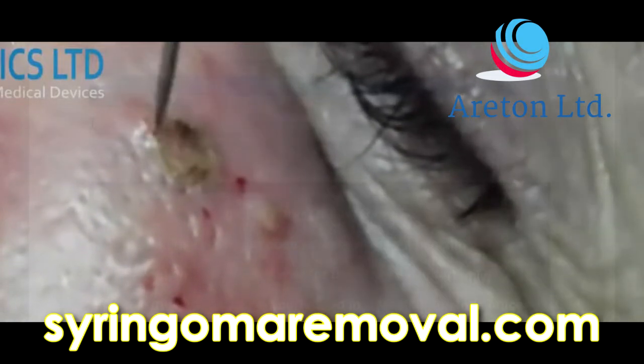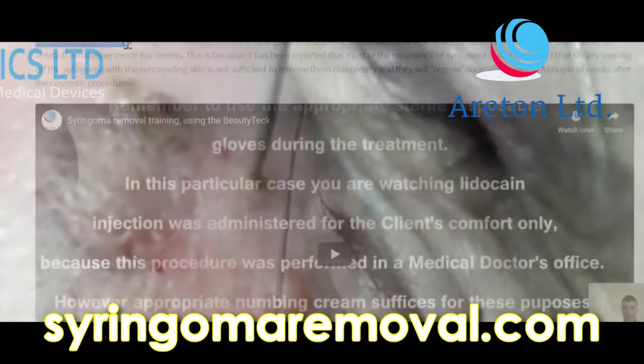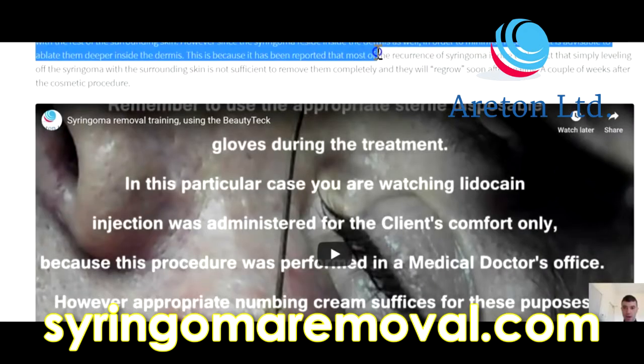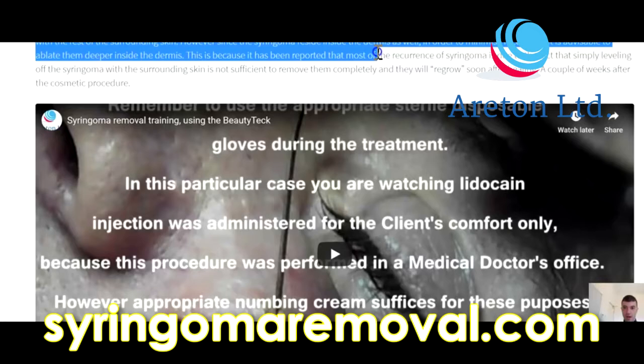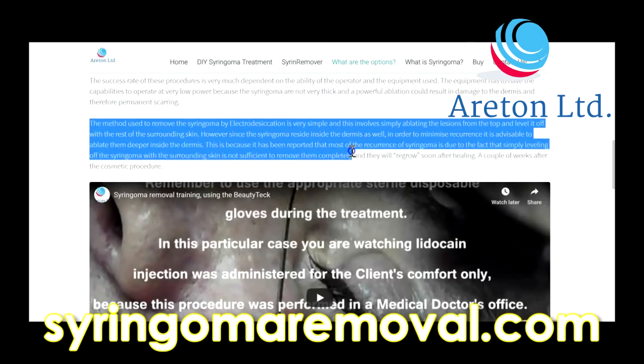This is the online training for our beauty technicians. The method used to remove syringoma by electrodesiccation involves simply ablating the lesions from the top level, levelling them off with the rest of the surrounding skin. However, since the syringoma resides inside the dermis as well, in order to minimise recurrence it is advisable to ablate them deeper inside the dermis.